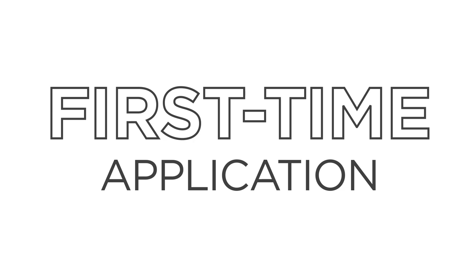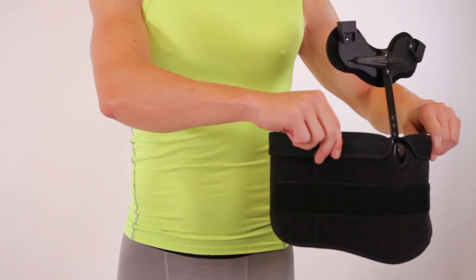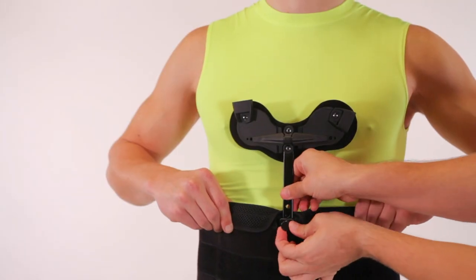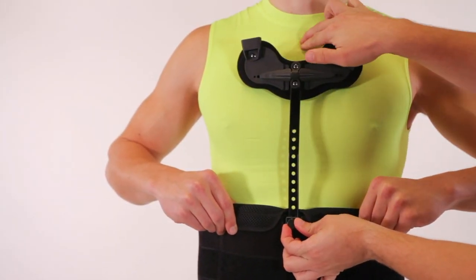First-time application is easiest with assistance. Position the abdominal plate so the bottom is at the beltline. Adjust the sternum attachment so it sits one inch below the sternal notch.